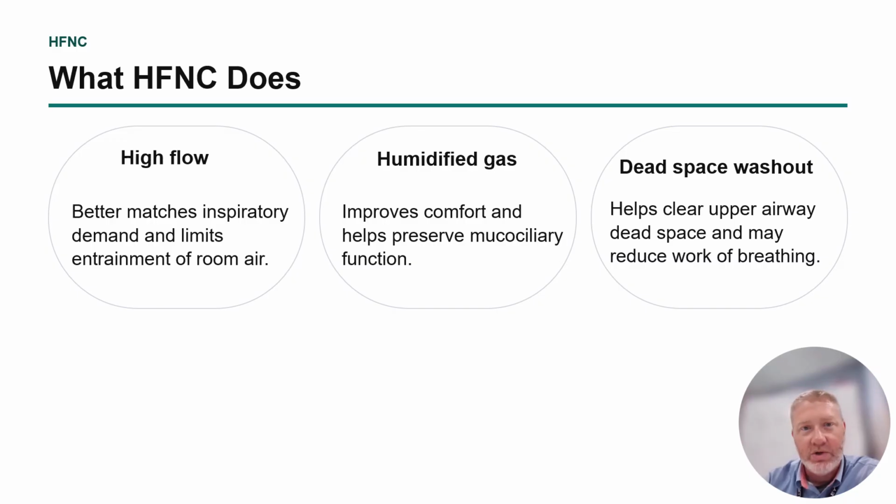I mean, up to 20. They benefit greatly because it helps to reduce their work of breathing by taking some of that pressure, literal pressure, off of them having to maintain that breathing rhythm. Okay.